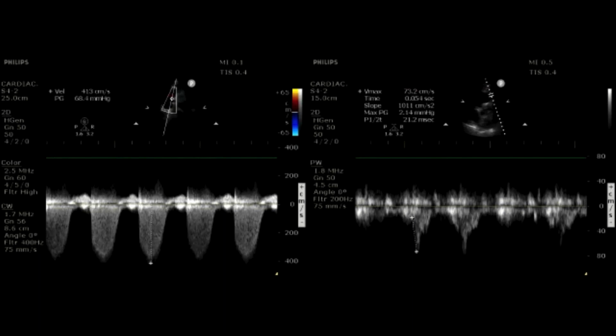Definitely more challenging in patients that have, say, COPD or left heart failure, which leads to pulmonary hypertension most of the time. The most common cause of pulmonary hypertension, at least in the patients that we see, is left-sided heart failure. So in those cases, diagnosing an acute PE can be tricky, but you go back and compare. When you go back and compare the right ventricular size and function, we often find that there's been worsening in terms of the size and function, and that sometimes is a clue towards the diagnosis of acute PE.